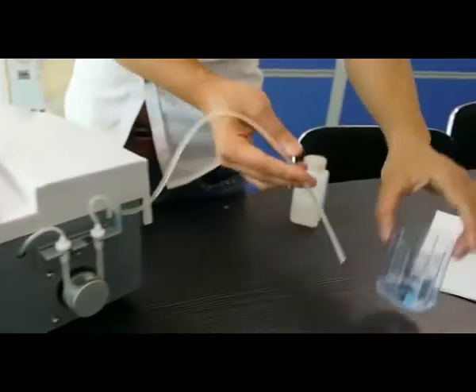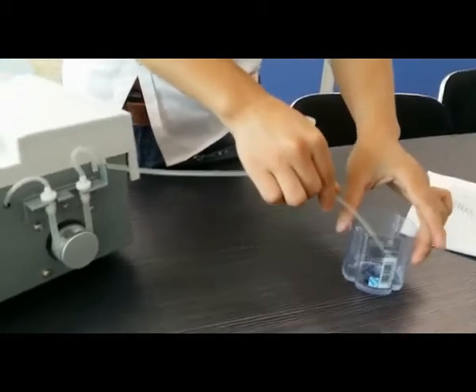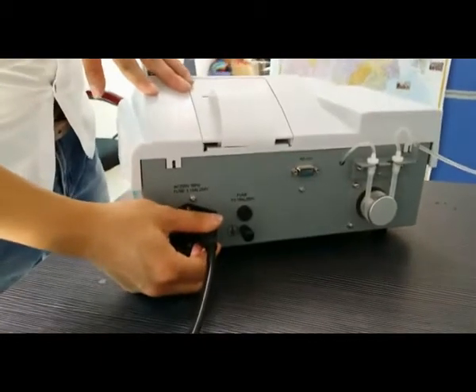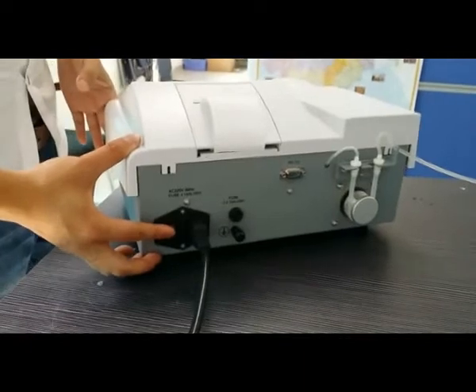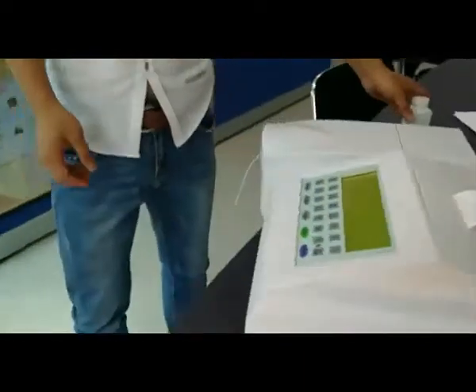Then put the waste tube into the waste bottle. Connect with the power line. Everything is ready. Then turn on the light. You can see the interface.